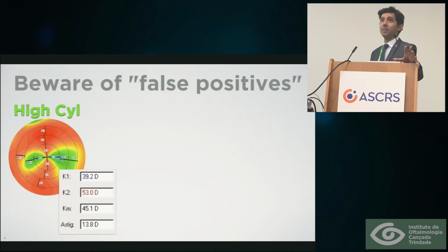The pinhole effect might be able to neutralize a small amount of regular astigmatism. I would say around 2 diopters, or even less than that. But those high cylinder patients, they need some sort of astigmatism correction, be it in the cornea with a wedge resection or an arcuate incision, or inside the eye with a toric IOL.